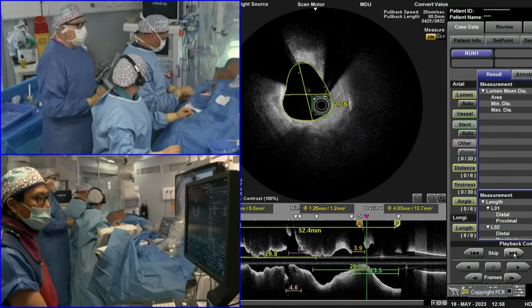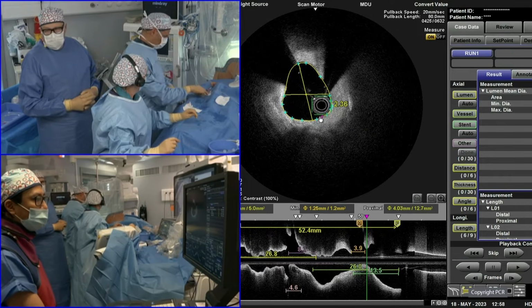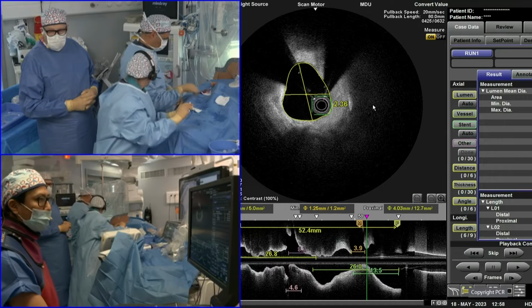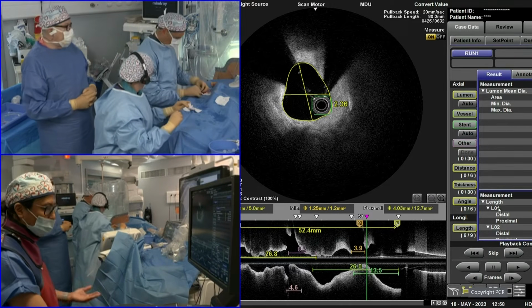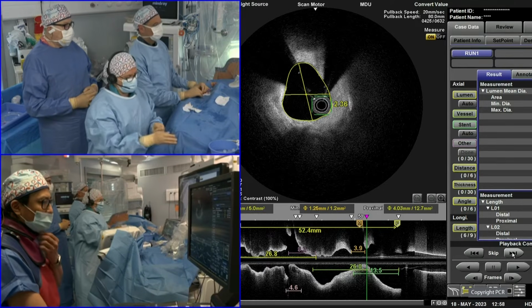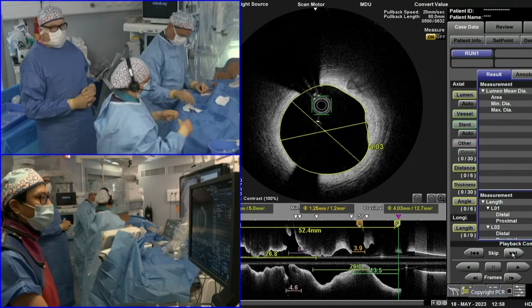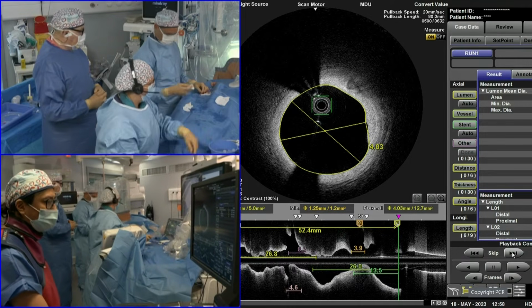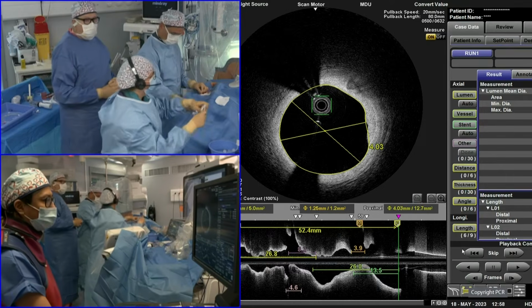And you can also see that the distal left main has a significant stenosis, diameter 2.36, area is 4.4 square millimeter. So I think it's also functionally very much significant, this disease. And proximal reference for the left main is 4.03 in diameter.